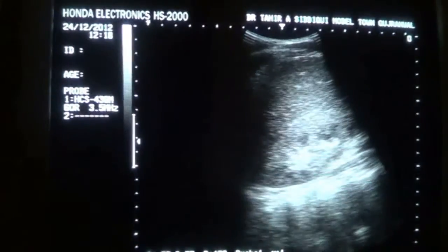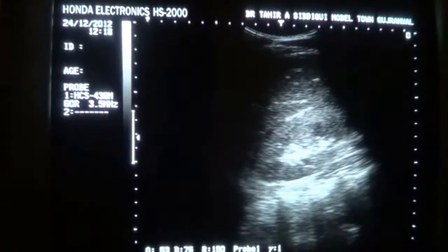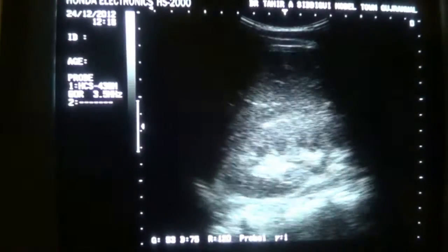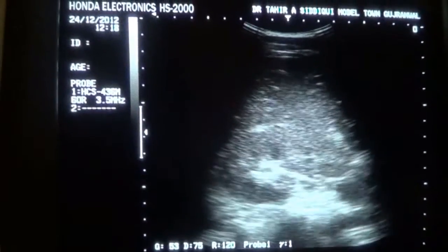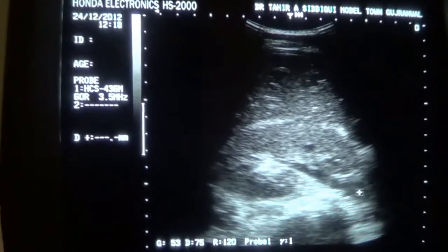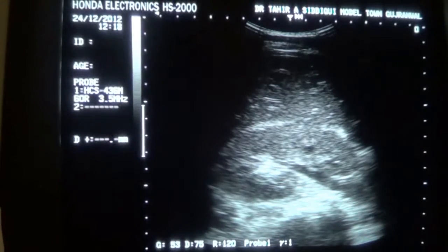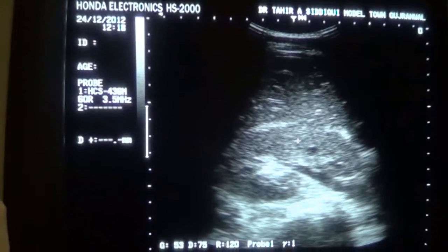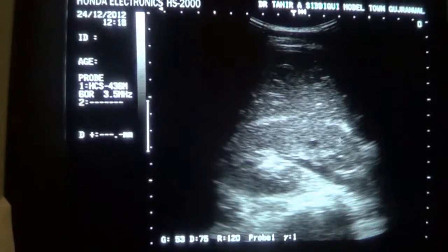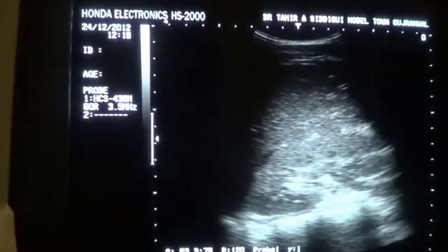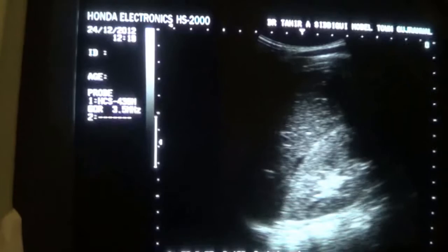This is the kidney, right kidney. Now this is the proximal ureter. This is the parenchyma, the anterior parenchyma of the right kidney. The echogenicity is diffusely increased and you can see a small amount of fluid.